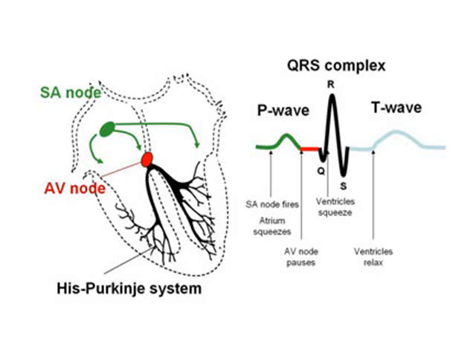And I found this on the internet. I was quite pleased with it because it shows the way that the impulse in the heart corresponds to the ECG, and this is how you can work out what's going on in an ECG if you can mirror up what's happening on the trace to what's happening in the heart. So the green bit is where the impulse goes from the SA node down the atrium, and that's the P wave. The red bit is the AV node, which is where you get your stop in the impulse, and then the ventricular contraction, the QRS, is this bit here when it comes down to the bundles.